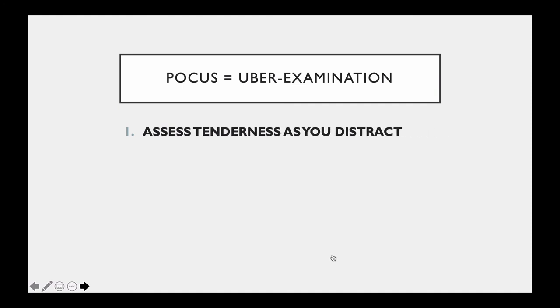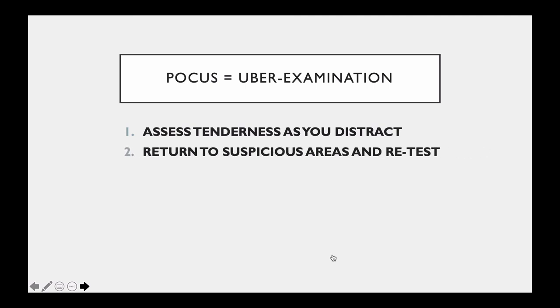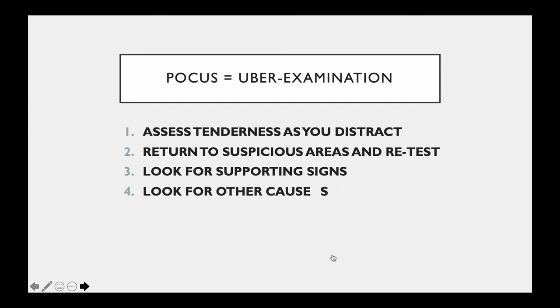I like it because I can assess tenderness while the patient is distracted and relaxed. I like to return to suspicious areas a couple of times to see if it's painful the second time around. I love looking for supporting signs. I think they're extremely valuable. And it's also a chance to look for other causes. Once or twice I've found an obstructed renal stone down in the right iliac fossa. I've certainly found several colitises and one or two tumours.